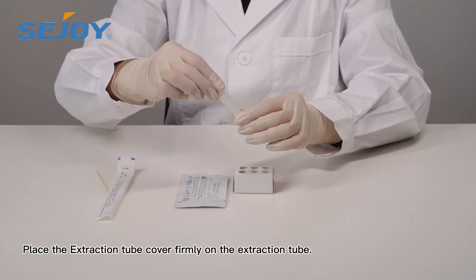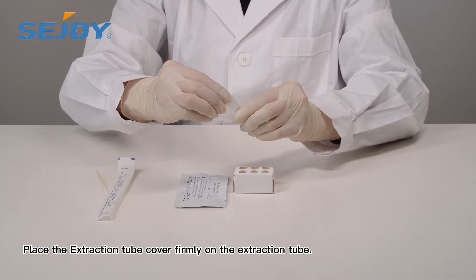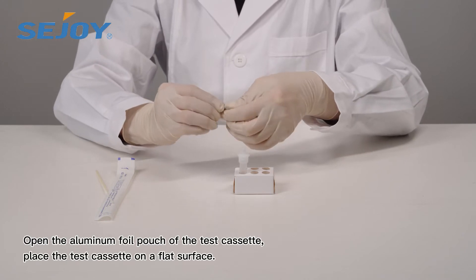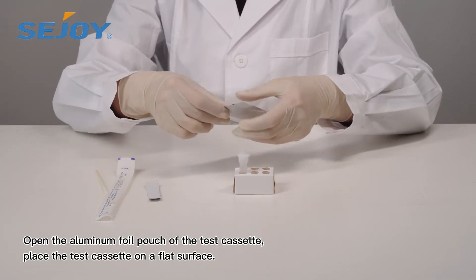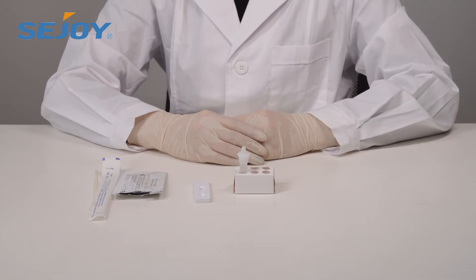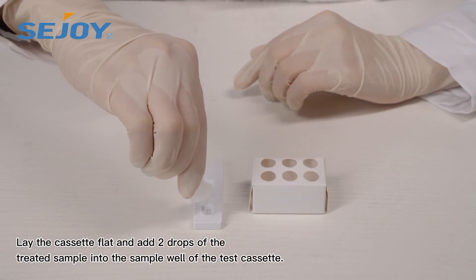Place the extraction tube cover firmly on the extraction tube. Open the aluminum foil pouch of the test cassette and place the test cassette on a flat surface. Lay the cassette flat and add two drops of the treated sample into the sample well.